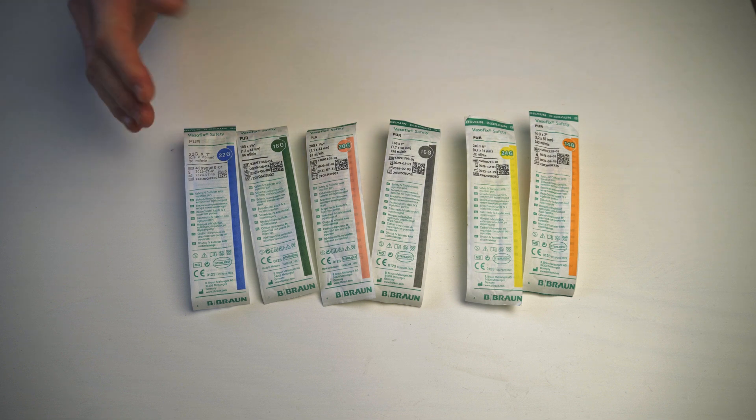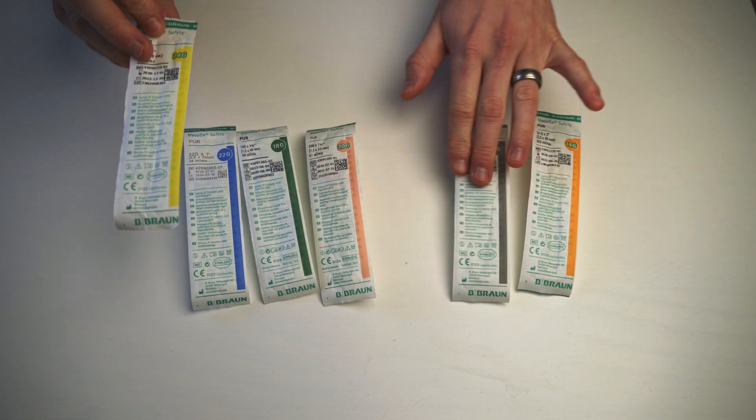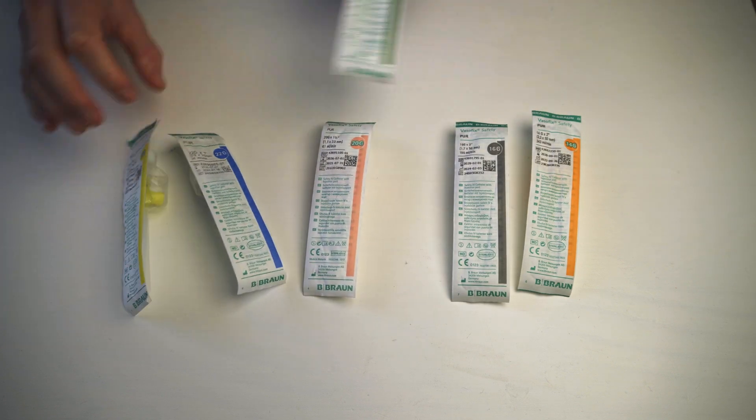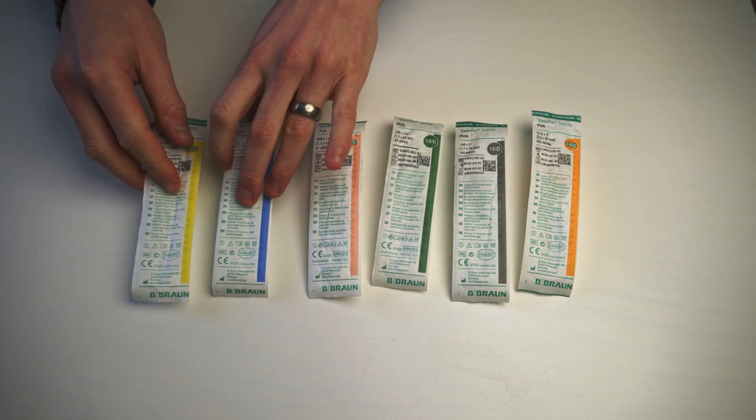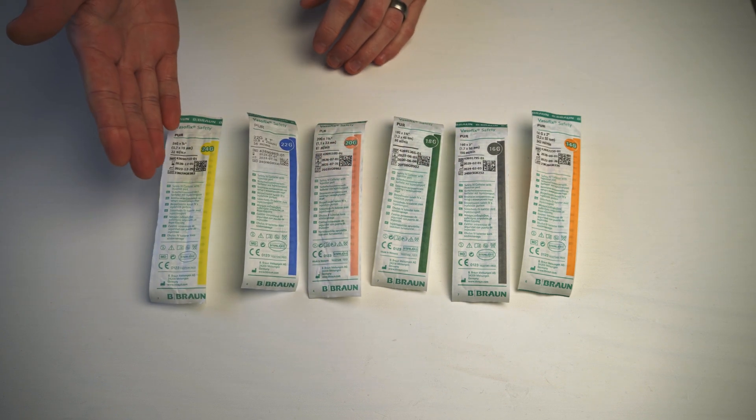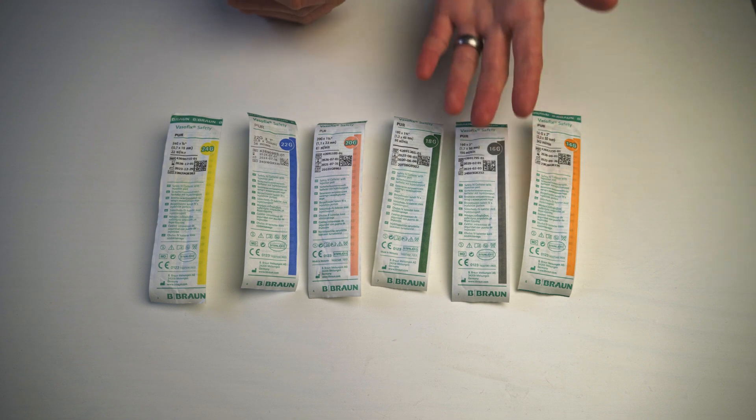So a baby or a child would get very small ones, and I can see these aren't even in line probably. So a child or a baby would get a very small one and an adult would get a bigger one.